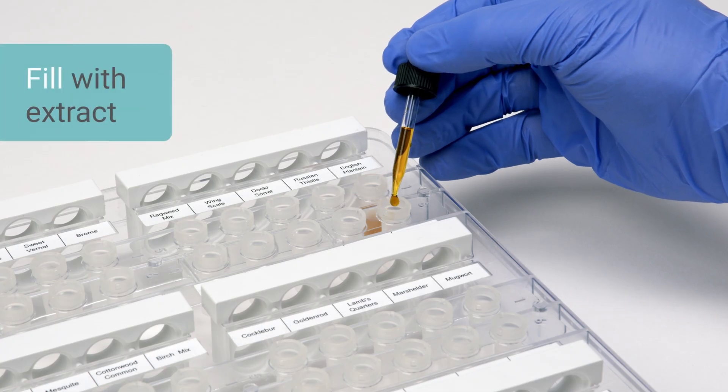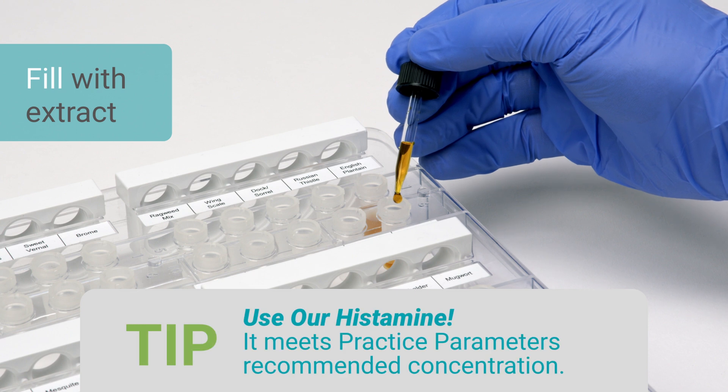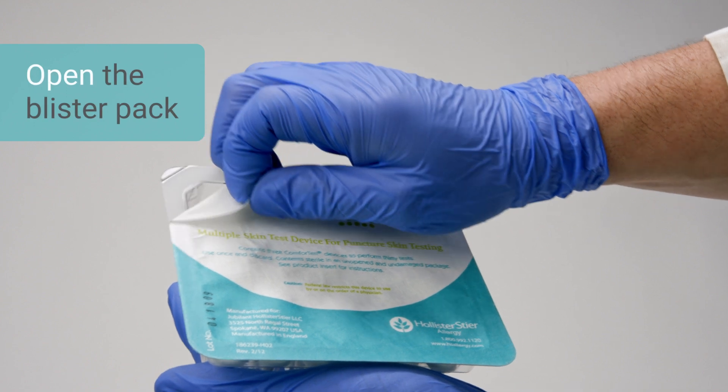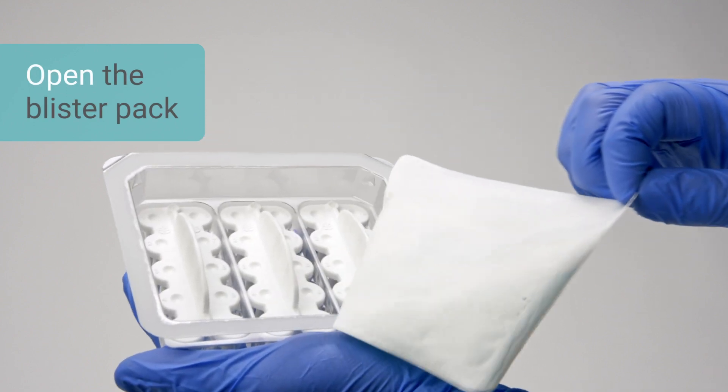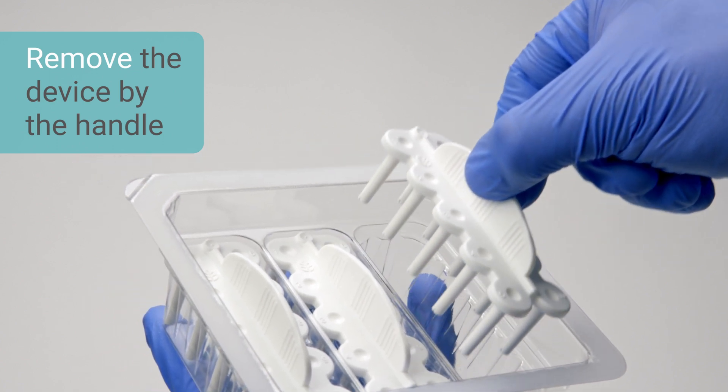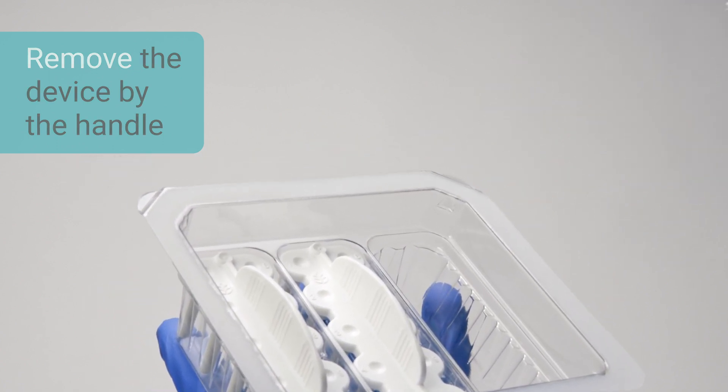Fill the appropriate reservoir with the corresponding extract or control. Open the Comforten or Quintip blister pack. Carefully remove the device by the handle, making sure not to touch any part of the legs or the lancet tips.